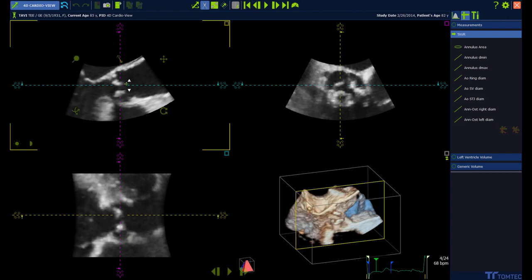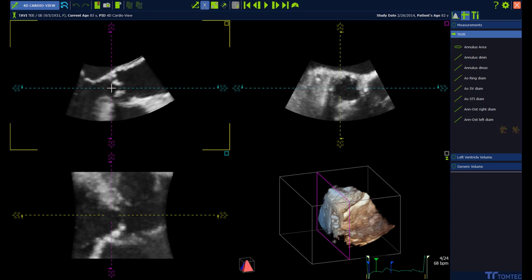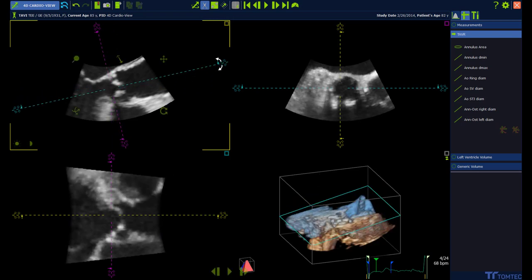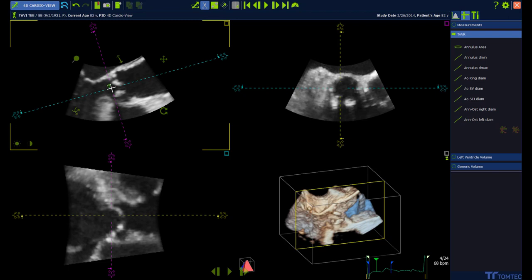In the next step the views have to be aligned to center the aortic view in all 3 MPR views. Move the lines of interest to the center of the aorta.